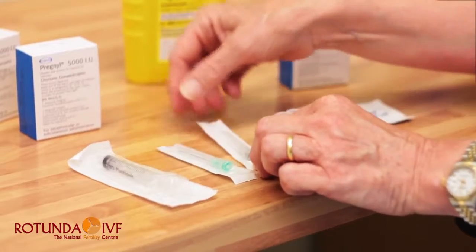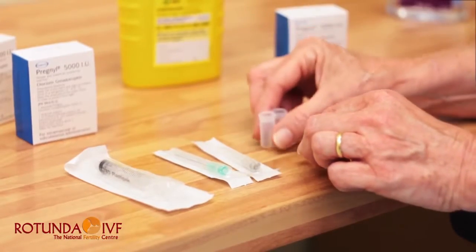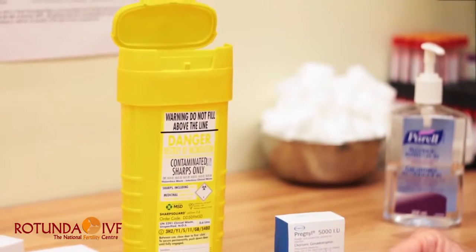The purpose of this video is to teach you the self-administration of a Pregnyl injection subcutaneously. You are provided with 1 box of Pregnyl if you are prescribed Pregnyl 5000, 2 boxes of Pregnyl if you are prescribed Pregnyl 10,000, a syringe, a long needle, a short needle, an alcohol wipe, and 2 ampoule covers, and a sharps bin for disposing of all your equipment at the end of the procedure.